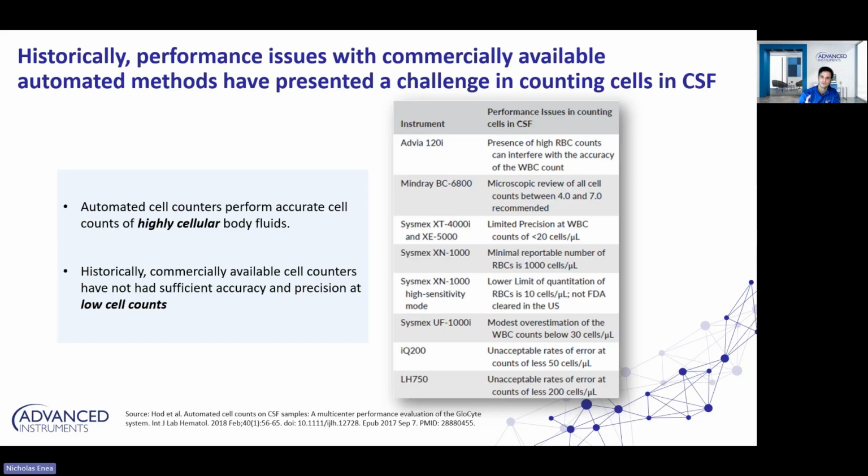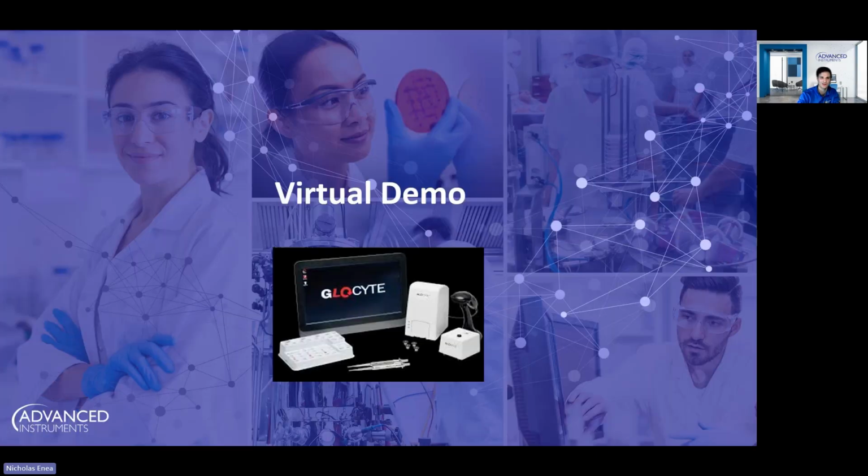So both methods, these are commonly used within the clinical setting right now. And what I want to show you, and Jordan's about to show you, there is a new, better way to do it.